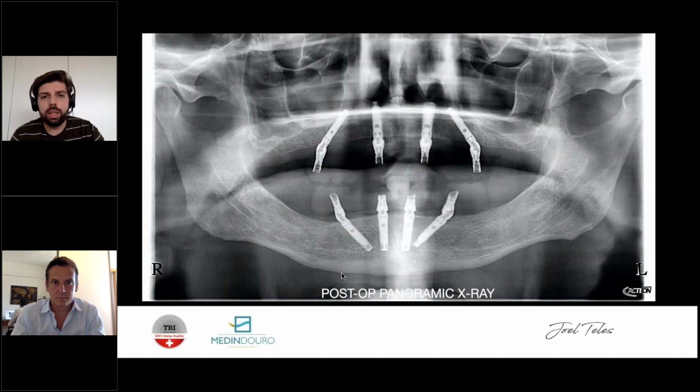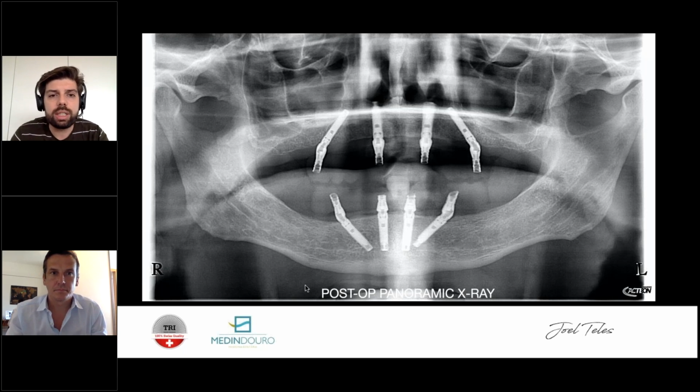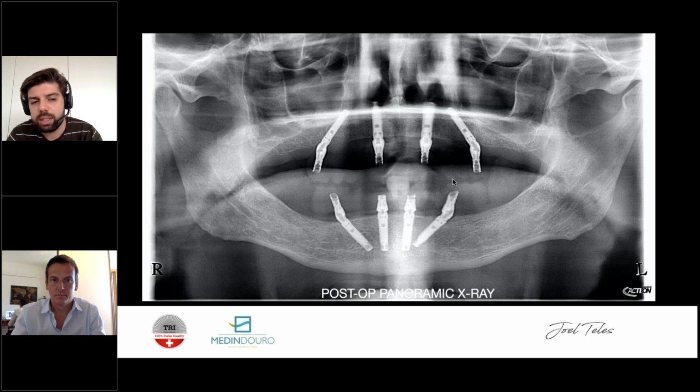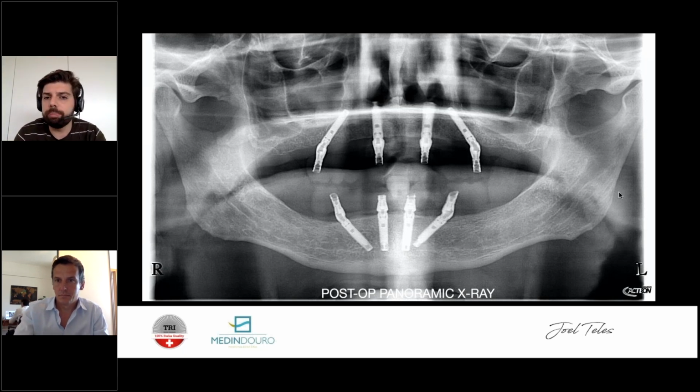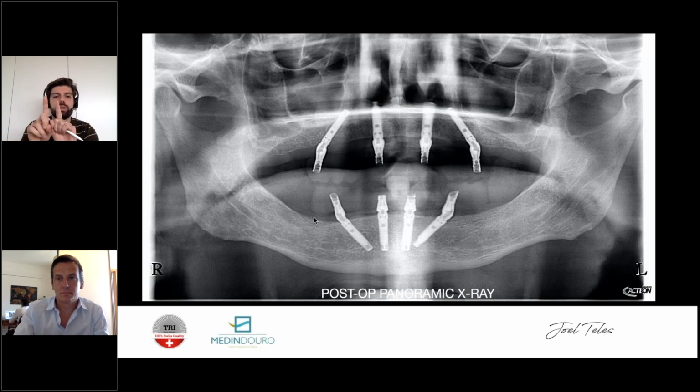Oh, one thing about this, because people were asking, if you look closely at this image, you will see the teeth here. So you can see that the prosthesis ends here and the prosthesis ends here. Normally I will not leave cantilevers on provisionals. I avoid cantilevers totally on provisionals. And you can see the beautiful symmetry. About all-on-4, this space in between the heads of your implants, for me, is key for success. I really do not like implants too close to each other.